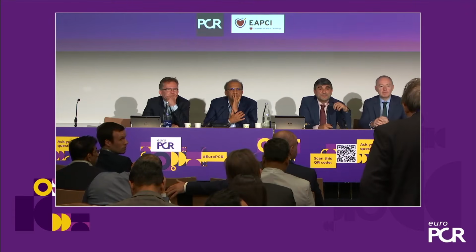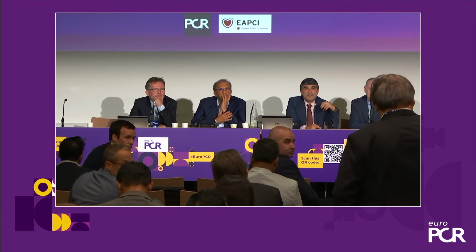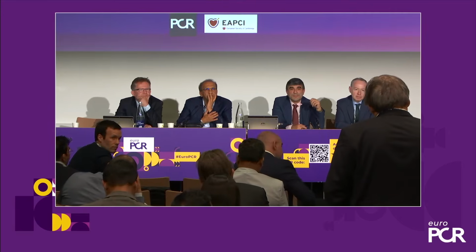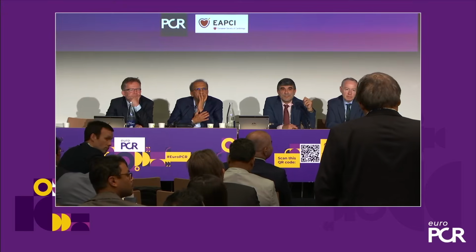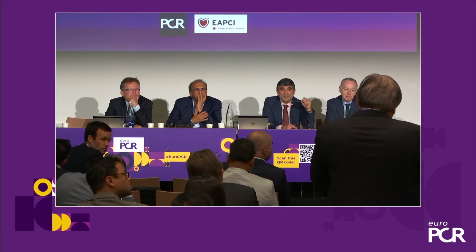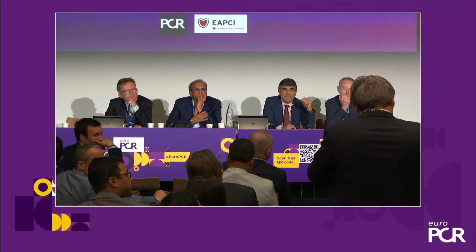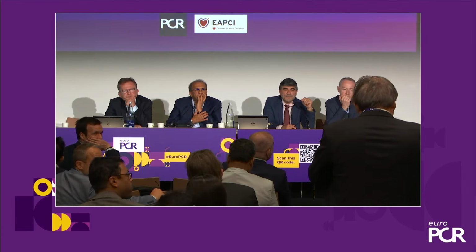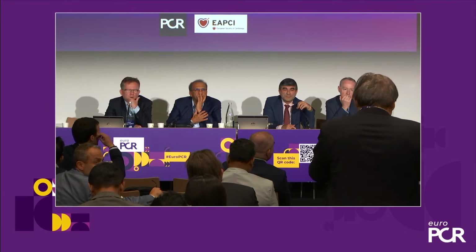Please go ahead. I'm from Romania, Târgu Mureș. I have some background. Between 2006 and 2012, I performed 100 laser interventions in coronary artery and maybe 300 in peripheral artery disease. After me, if you cross with a guide wire, maybe you can try it with a very small balloon, because laser is costly in Romania, maybe not in Spain.